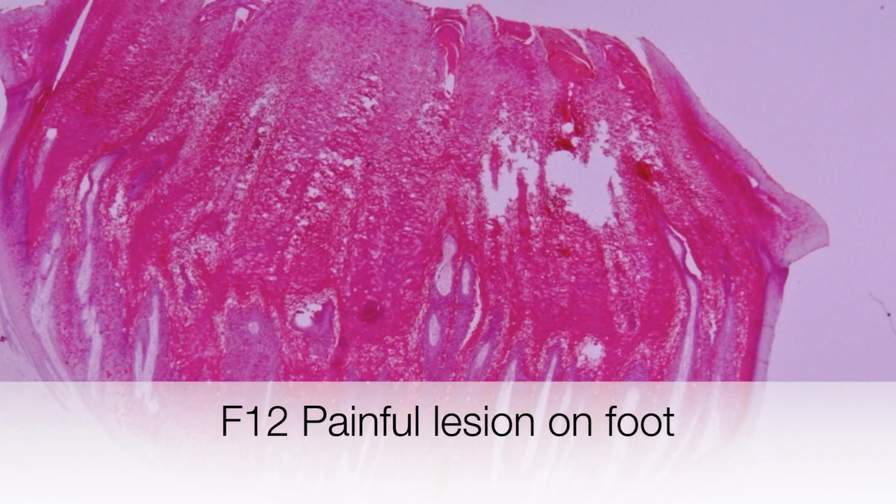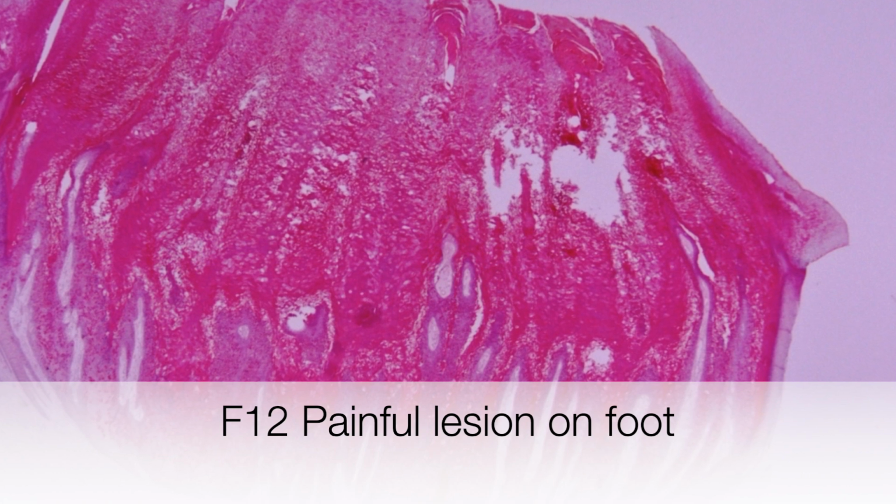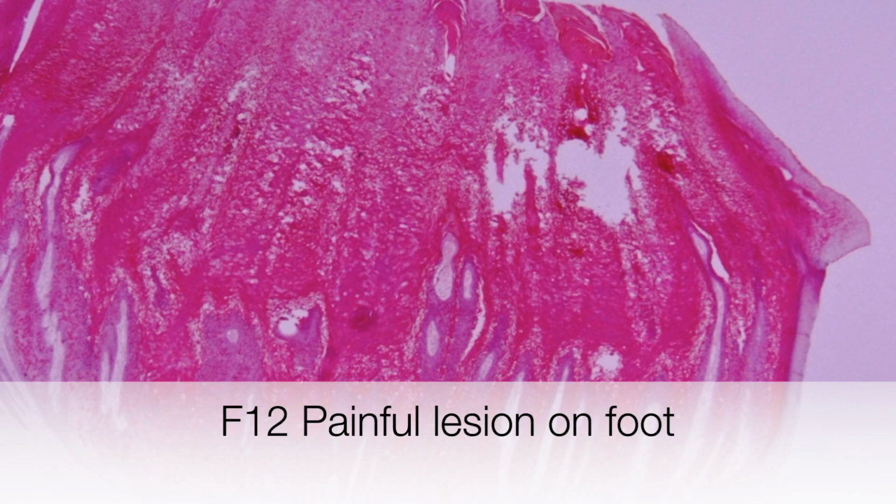Case number 2 is a female of 12 with a painful lesion on the foot. What is it? Here is a higher power view.